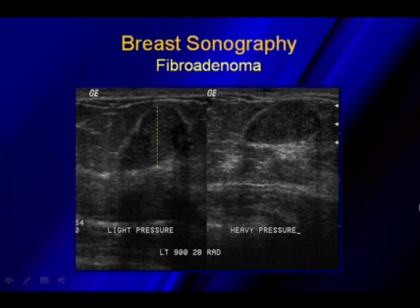If we compressed, we could actually change the orientation of this and make it parallel to the skin. This particular patient elected to not have a biopsy. We followed her for 3 years out, and this never did change in size.